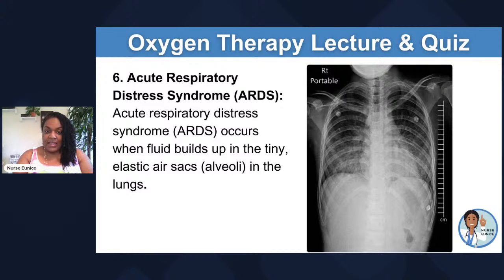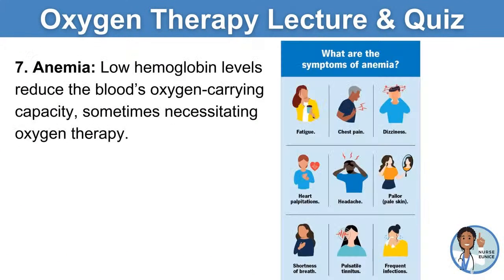If you're a CNA, CNAs do not turn up the flow or the dial on oxygen. Oxygen's a drug. You cannot change the dial. But what you can do instead is notify that nurse, make sure you actually check the oxygen saturation and the other vital signs. And if something has disconnected or if the patient doesn't have their device on correctly, you can fix that. So there are things you can do if you're not a nurse or a respiratory therapist.